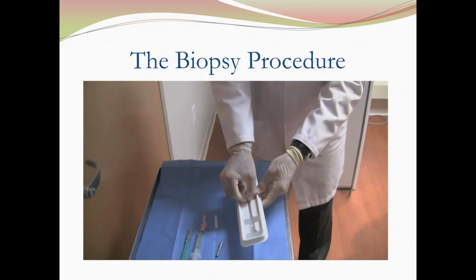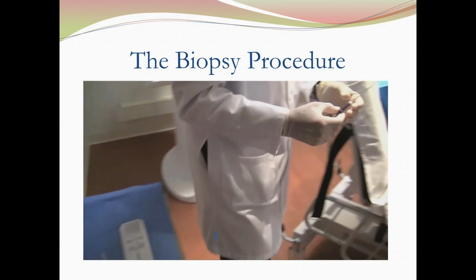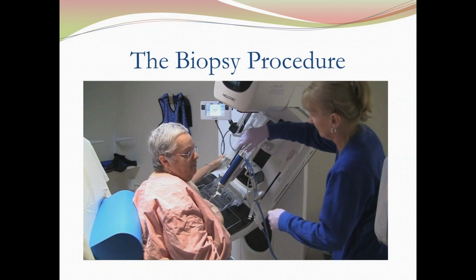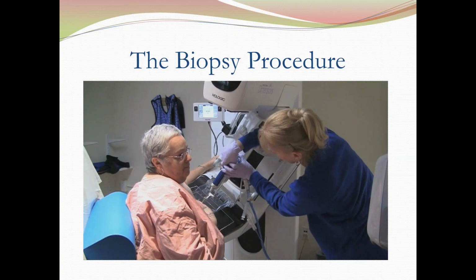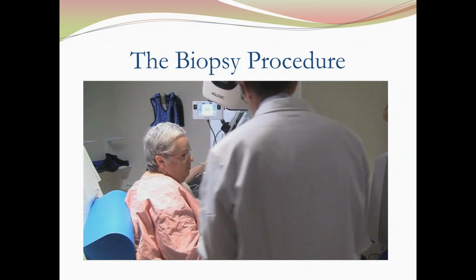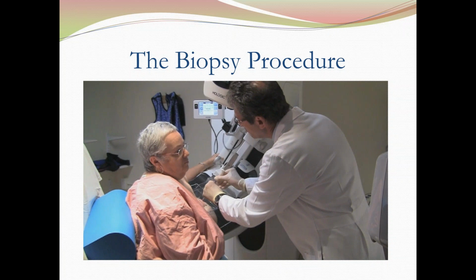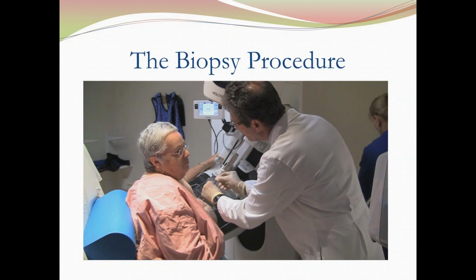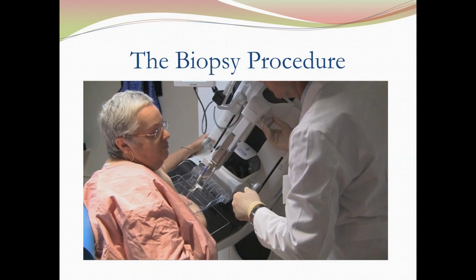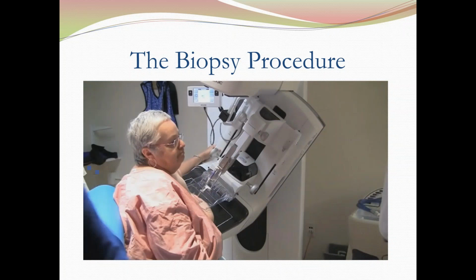And now I'm going to put the clip in. Same clips that we use if we do a prone case. So she removes the needle, leaving the sheath in place. So the sheath is still at the lesion. And I'm going to go ahead, and this clicks in place, and I'm just going to depress the plunger, deploy the clip. I'm going to back out the sheath a little bit just to expose viewing the clip.